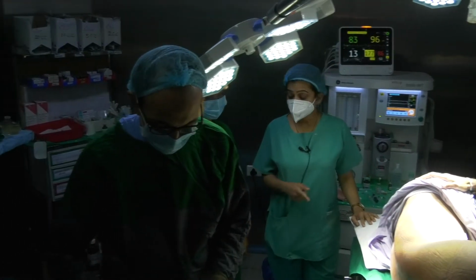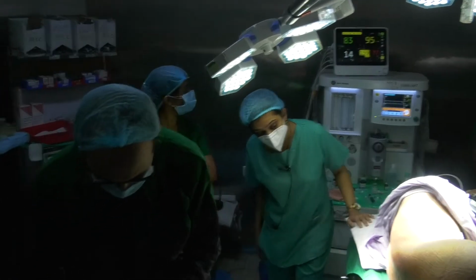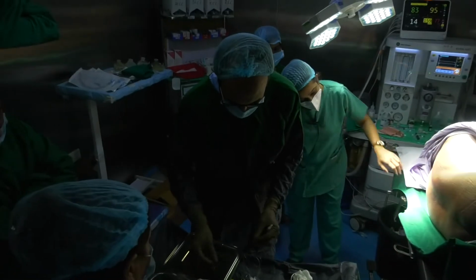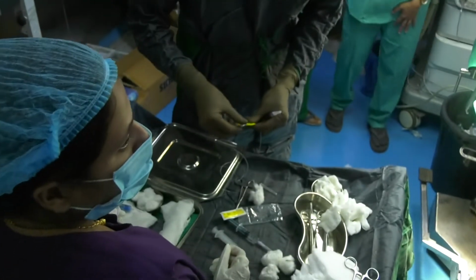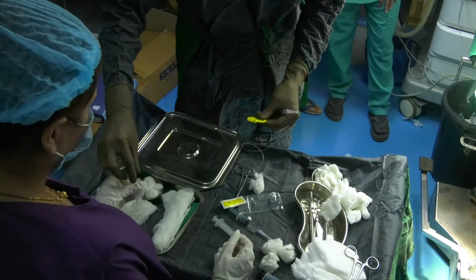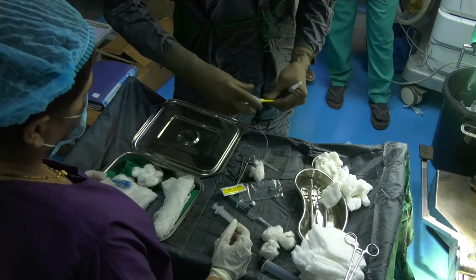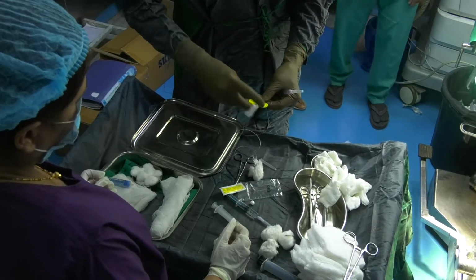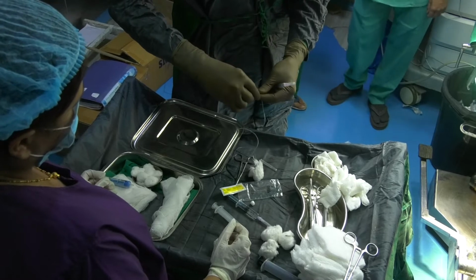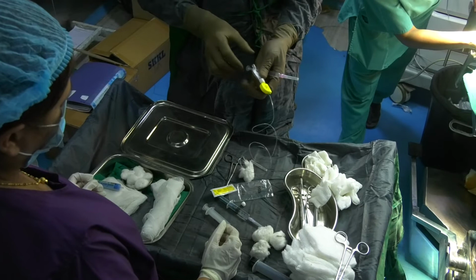which we are using for continuous spinal. You have to take into account the dead space of the catheter for continuous spinal. It is roughly around 1 ml.